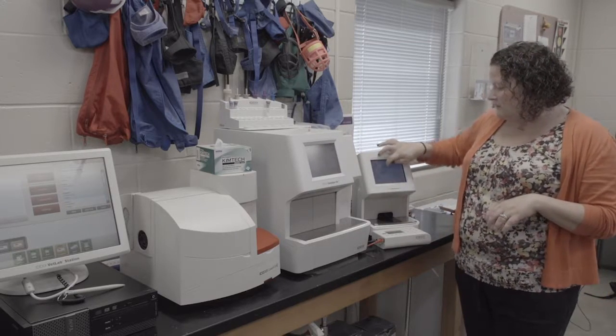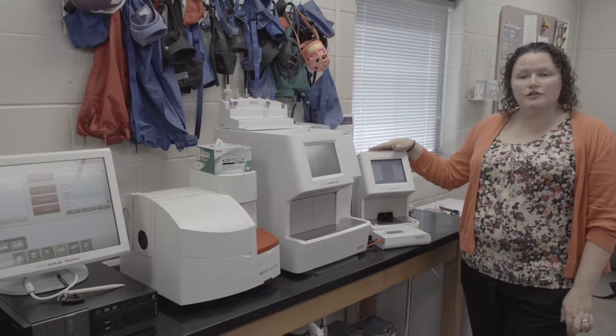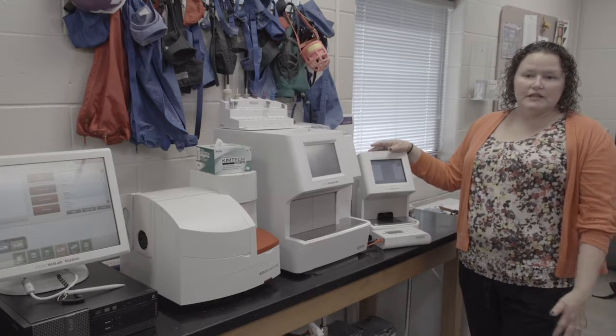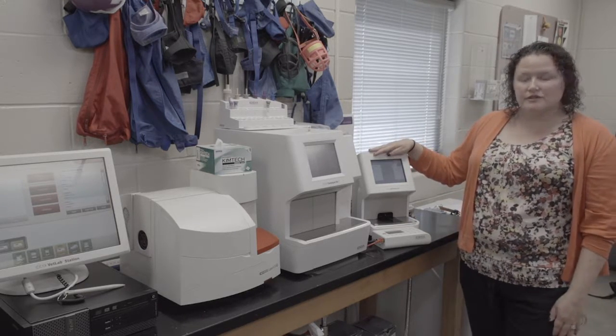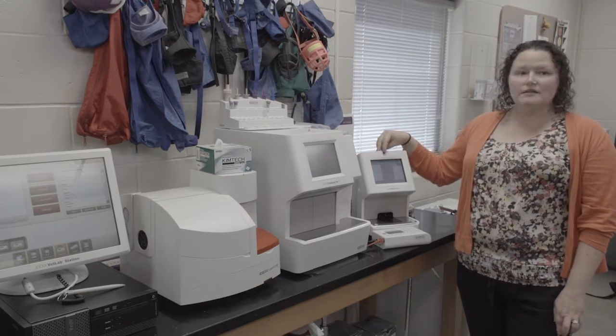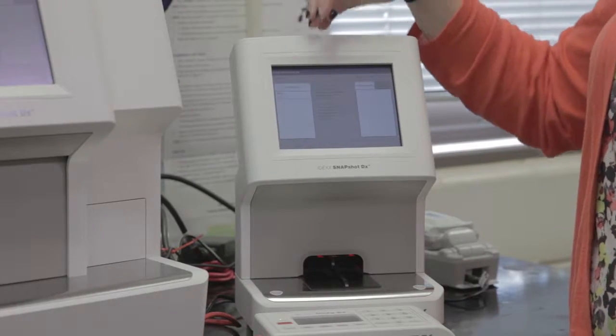Okay, so moving down the line, this is your SNAPshot. This is where you will run your bile acids and cortisol, but you will also run your 4DX, your feline triple, your combo, any of those other SNAP tests on here. The nice thing about this analyzer is it times it, and it then reads and records and interprets the result for you. So you can load this and walk away.